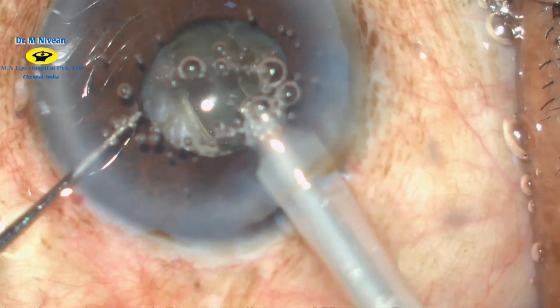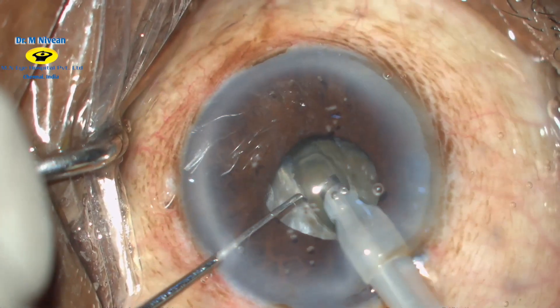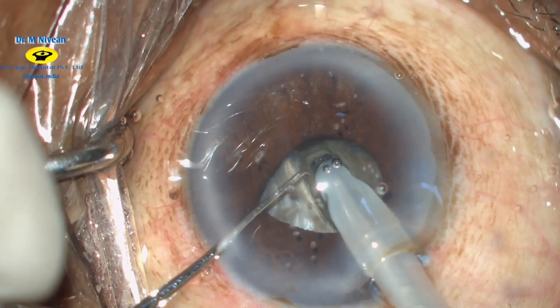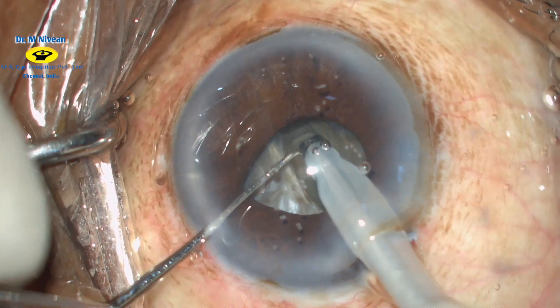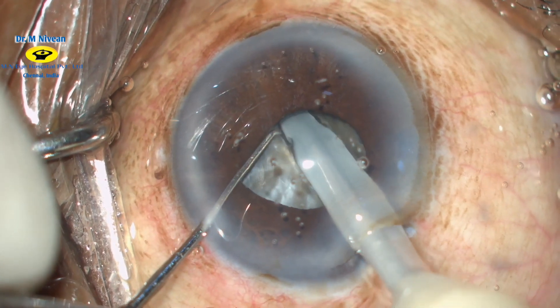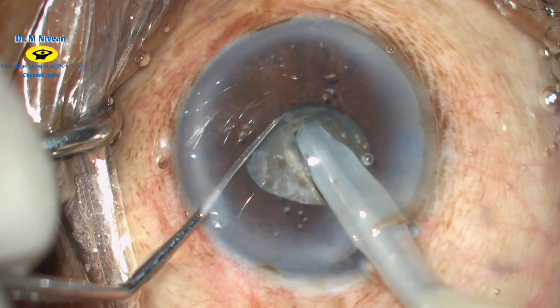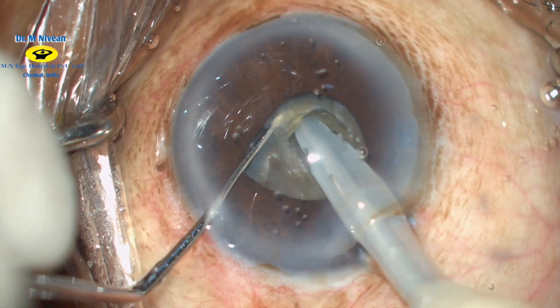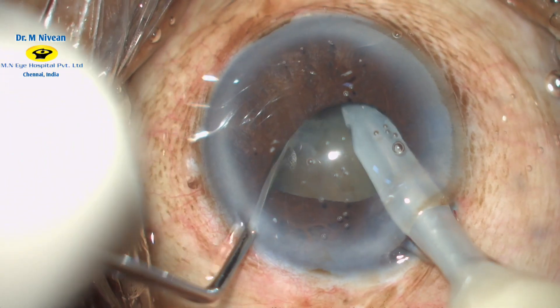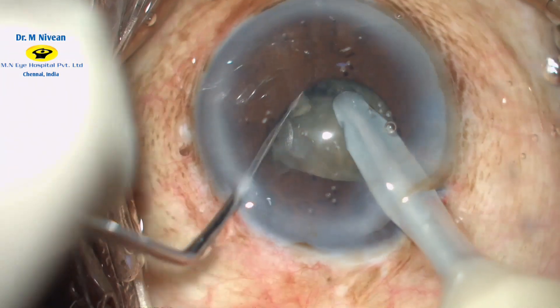The tip here is that we should stay within the pupillary margin at all times. Now switching to phaco 2 mode, the modified chop technique is used to bury the phaco probe into the equator of the nucleus. This is then slightly lifted up and the crack is initiated with the second instrument.